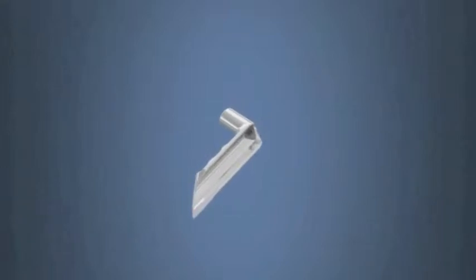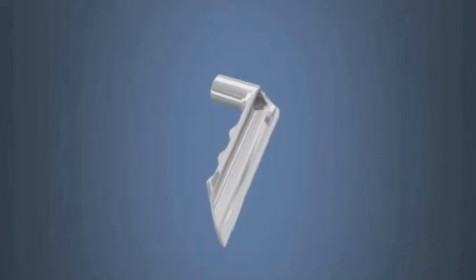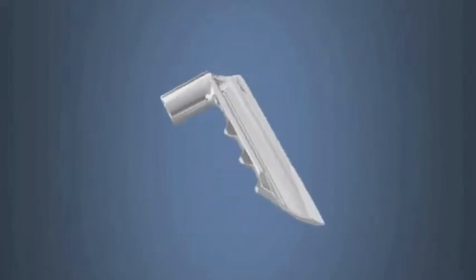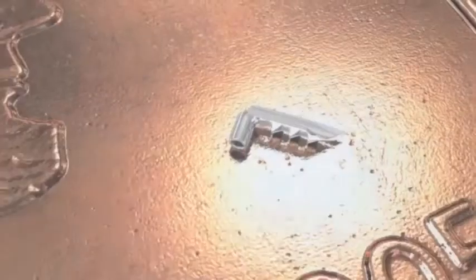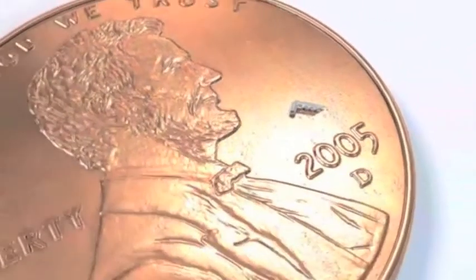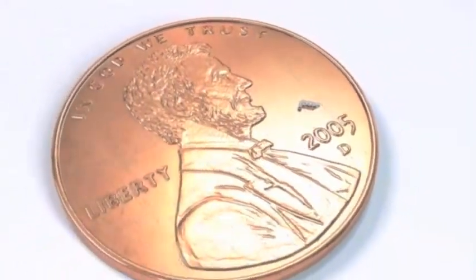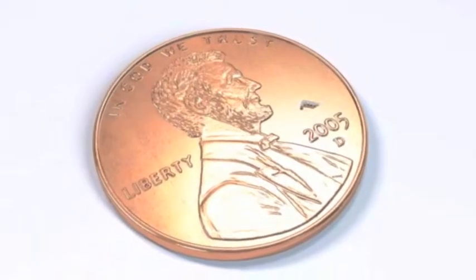The eye stent implant is the world's smallest medical device and can be surgically placed into your eye. In patients with mild to moderate glaucoma, the eye stent device is designed to lower intraocular pressure and some patients may experience a reduction in their glaucoma medications.